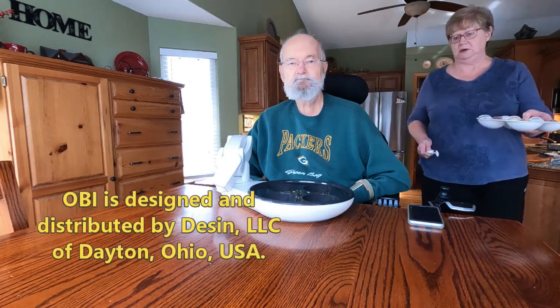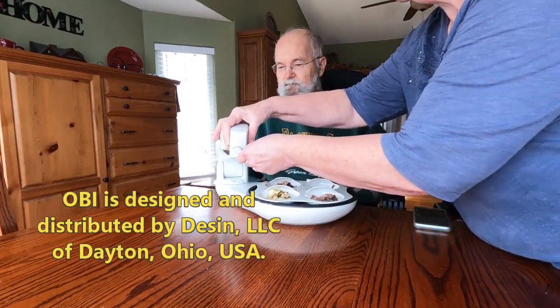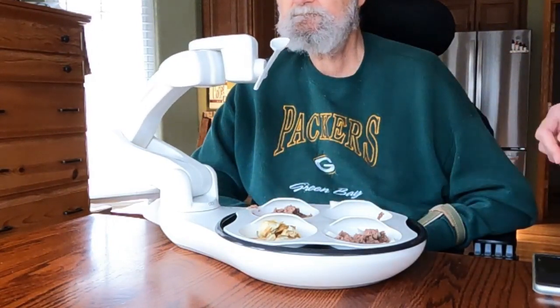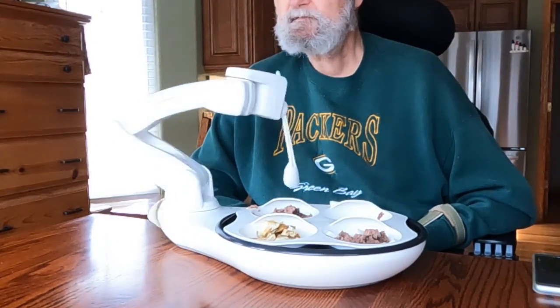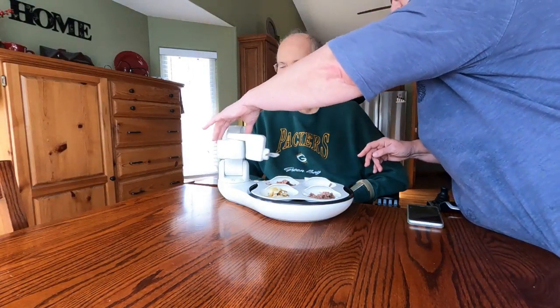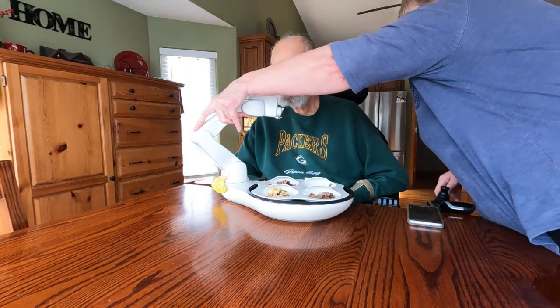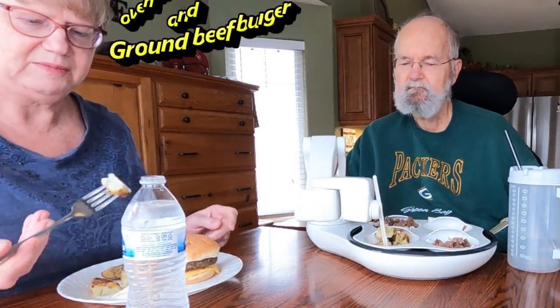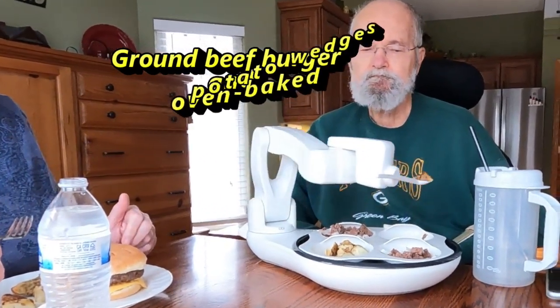Cindy has prepared a nice meal for me, dished it up into OB's four-section dish, and positioned it on the robot's placemat base. Before letting me eat, she turns on OB, allows it to go through its short start-up ritual, then presses the train button before covering the learn button on the arm and moving the spoon's location to the delivery location just in front of my mouth. When the delivery location has been determined, the train button is pressed one more time and it's time to start eating. I'm operating the two pressure switches to operate the OB that are laying on my lap.